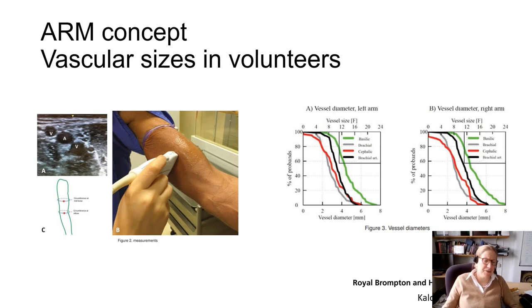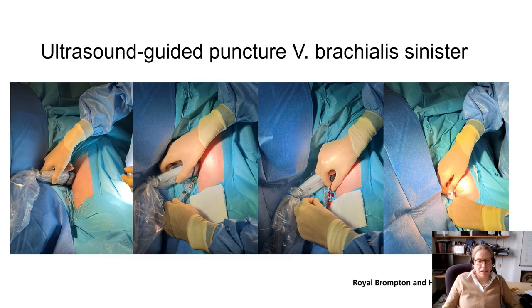And you see here just an example of the brachial artery with the two brachial veins here, right and left of this left arm. So the technique on how to do this is an ultrasound guided technique, as nowadays every central line is punctured with ultrasound. That's very easy. The same technique as the ultrasound guided Seldinger technique. So you see the vessel, you puncture with a small needle set, ideally with a radio opaque echogenic needle tip, and then you aspirate same way, Seldinger essentially.